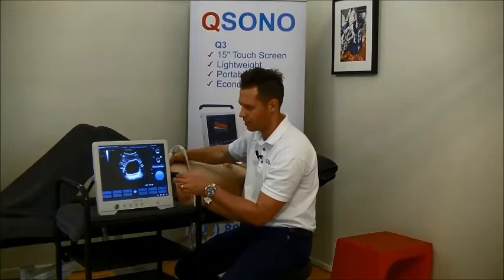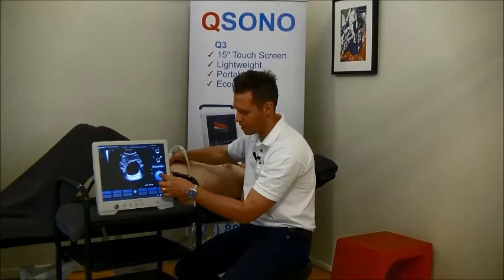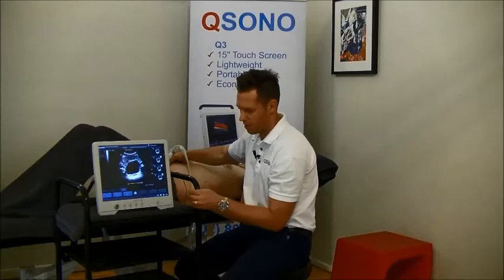Okay, there's a contraction, but could I get you just to relax and go back again? Switch everything off. Okay, and now when you do a pelvic floor contraction, I'm going to measure the size of that contraction with my caliper. Okay, nice and easy, hold it there, hold it there. Perfect. So now we have an objective measure of how much bladder base elevation there was.